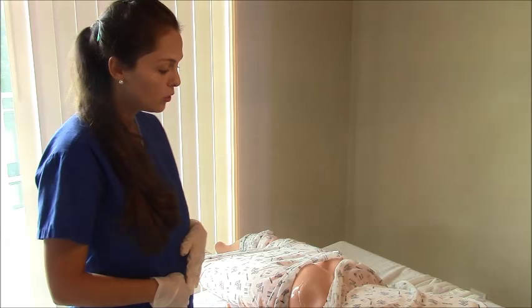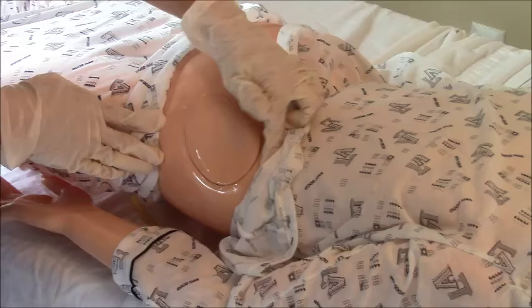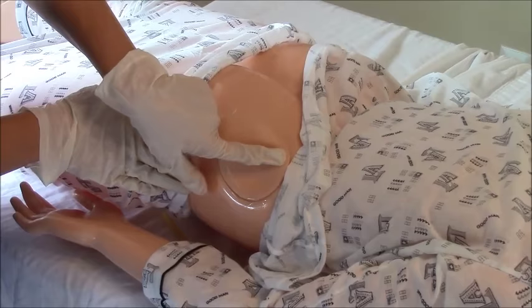The key to giving these injections is finding your landmarks. You'll want to find the greater trochanter and then you'll want to find the prominence of the iliac crest, which is about in this region right here. Once you find your greater trochanter and the prominence of the iliac crest, you'll want to draw an imaginary line.